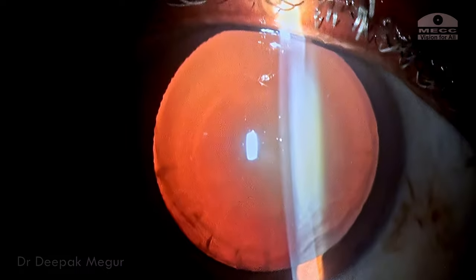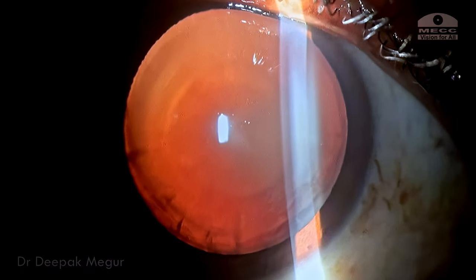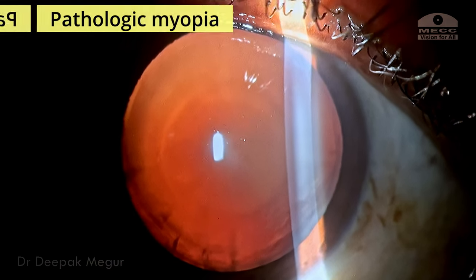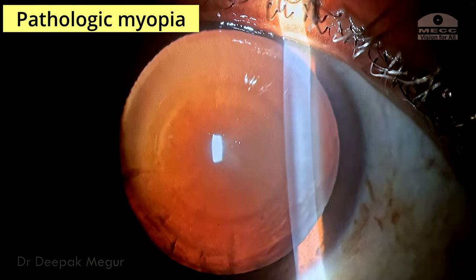Let's talk about cataract surgery in pathological myopia. This is a 65-year-old lady who has been wearing thick glasses for all of her life and has now come for cataract surgery.